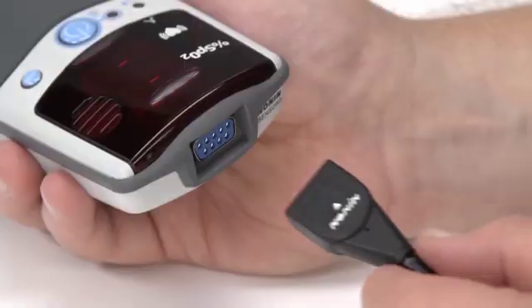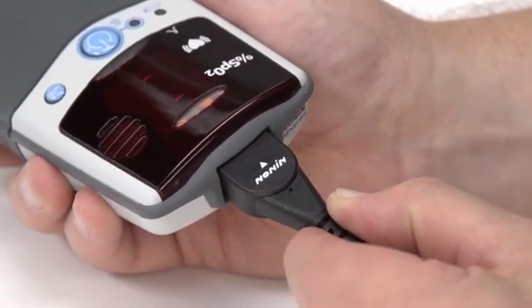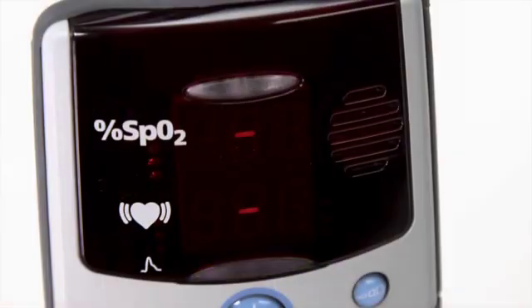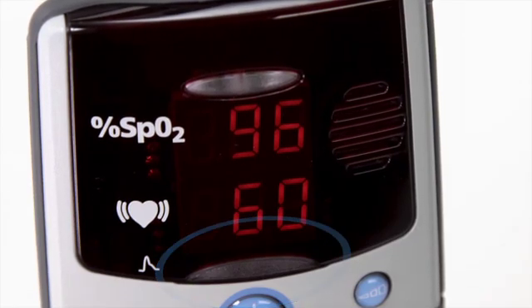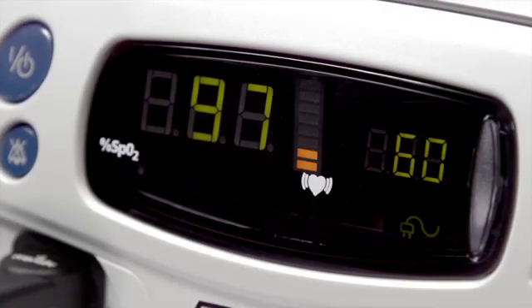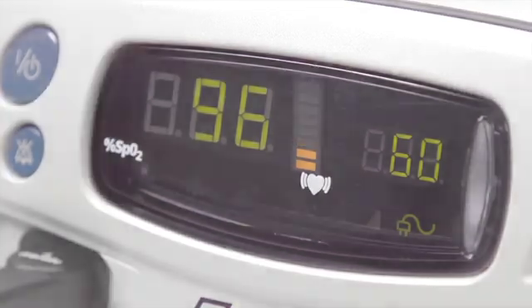You're ready to use the Nanan pulse oximeter to measure oxygen saturation and pulse rate. Nanan pulse oximeters have a signal quality display that measures the sensor signal. If the signal is low or moderate, the emitter and detector may not be in proper alignment.